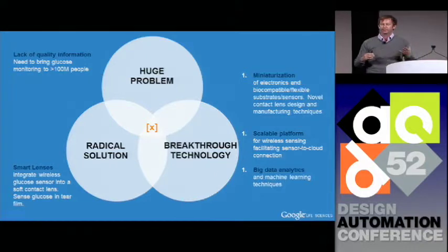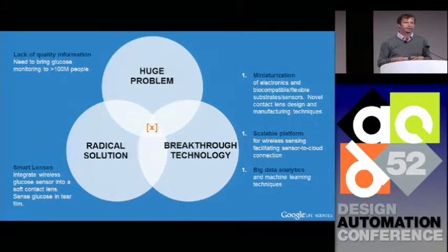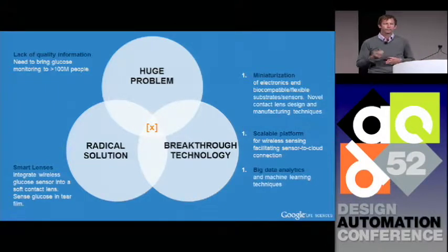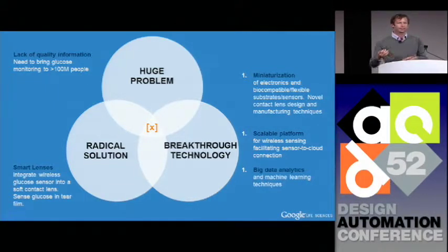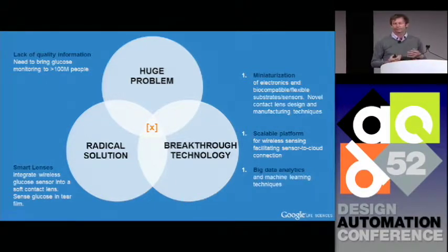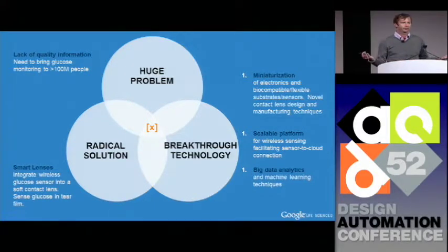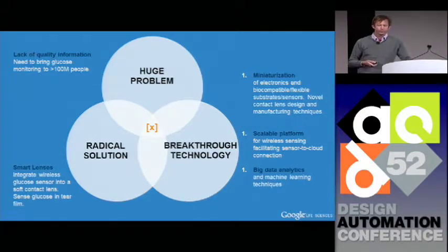And it's not just making it smaller, it has to be flexible. It has to be essentially two-dimensional, mass-producible, and extremely cheap. Second, we have to make a true platform. This is not intended to be a single, one-time diagnostic when you check into the hospital. We want this to be a true wearable device that's comfortable, that seamlessly integrates into your lifestyle, because this is not intended to be for the most severe patients. This is intended to be for all of us as a proactive way of improving our lifestyle.